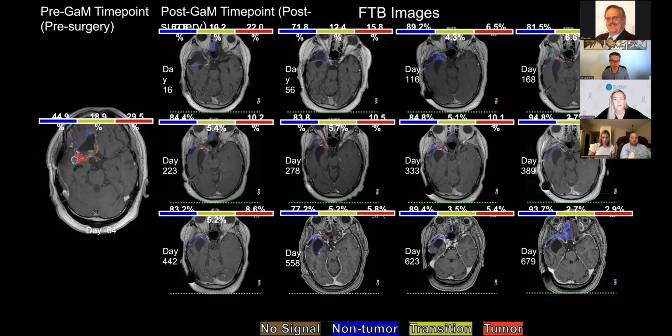And I think that's my call to arms, so to speak, that I would like to have clinical trials incorporate this. Part of it has to do with getting those clinical trials organized to acquire DSC perfusion on a regular basis during post-op, because a lot of times, believe it or not, despite this technique being super useful, there are still a lot of practices out there that are not acquiring this on a routine basis.